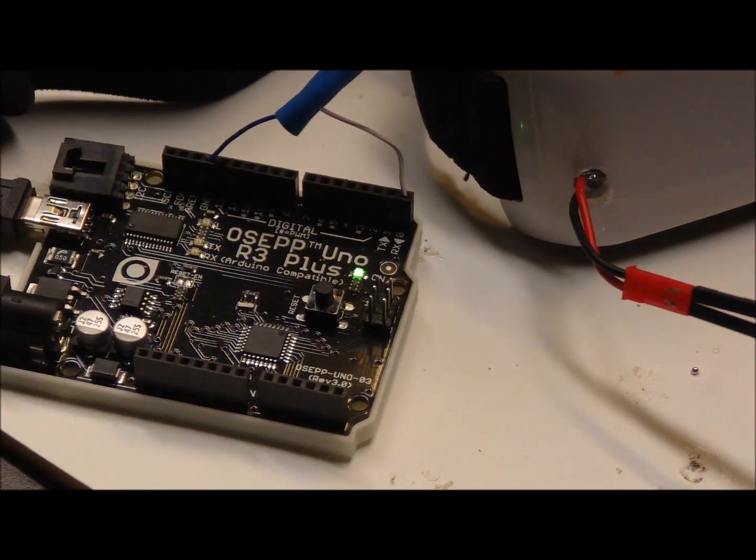And I know this is going to be really lousy videoing a screen, but this is the Uno sketch. You just do a search for Arduino brain interface or the MindFlex Arduino, and you'll find this sketch. It's on multiple pages. Anyway, I'll plug in the Arduino. We're going to get some data flowing there now. We're showing we're receiving, and we'll click on the serial interface and let's see what we get.